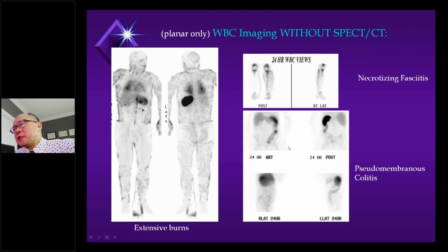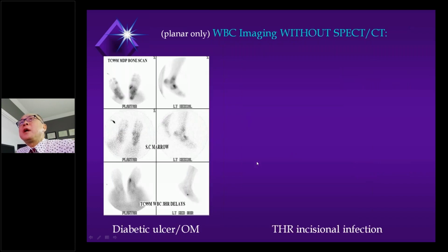Of course, in this patient, we would have done a 1 hour dynamic acquisition to ensure that this does appear early at the 1 hour mark, but you can clearly see the distribution of colitis. So planar images certainly have value, but even for small parts preceding SPECT-CT, when we didn't really have a choice, you do what you can.